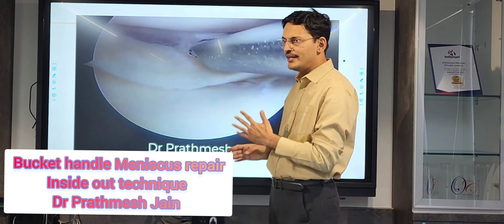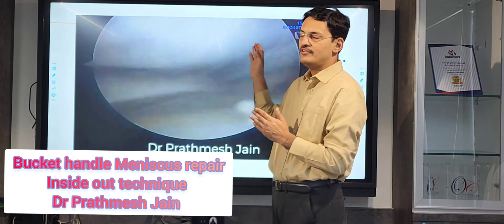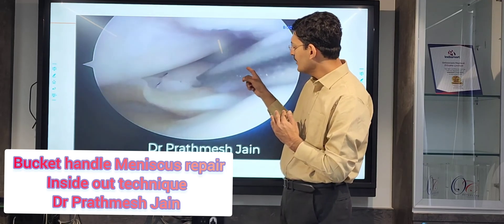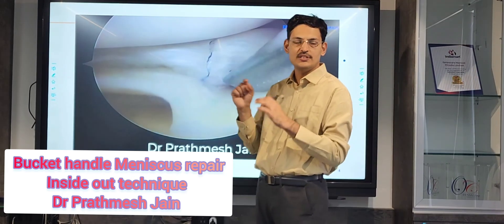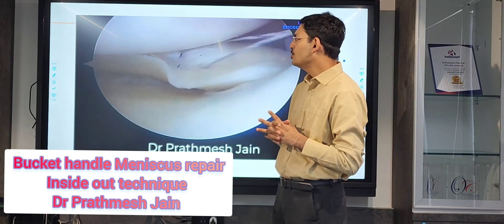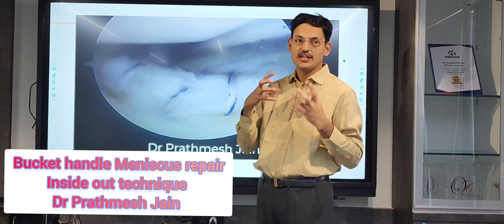We start from posterior and go anterior, beginning with more angulated cannulas — 40° initially, then 30°, 20°, 10°. We use a disposable inside-out needle system: two needles connected with two-zero fiber wire sutures. In this kind of repair, you should not shy away from using a large number of sutures, as the number of sutures determines the strength of the repair.